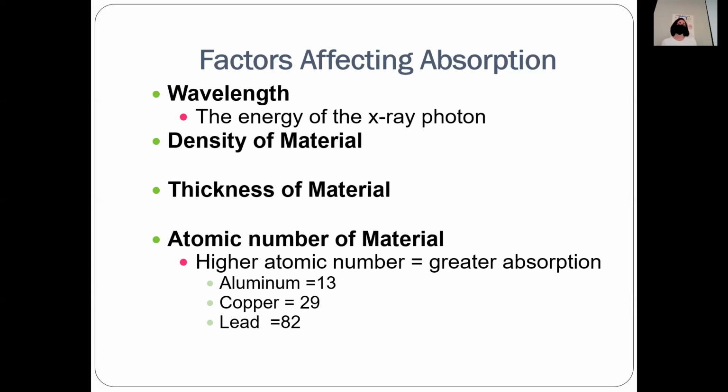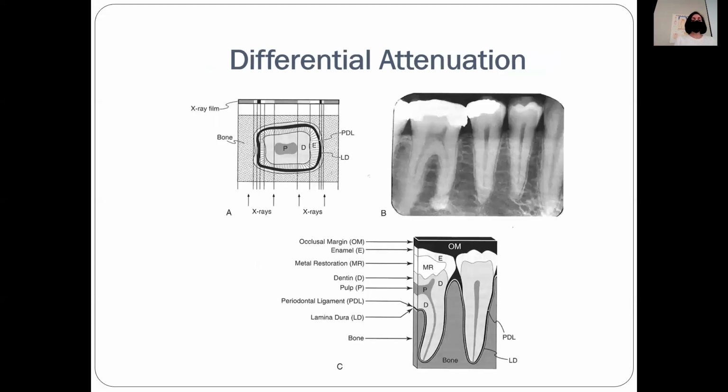So it's pretty much all white. But porcelain shows up less radiopaque than, say, gold. So that shows up different. We're almost there, guys. Two more, and then we'll take a break.